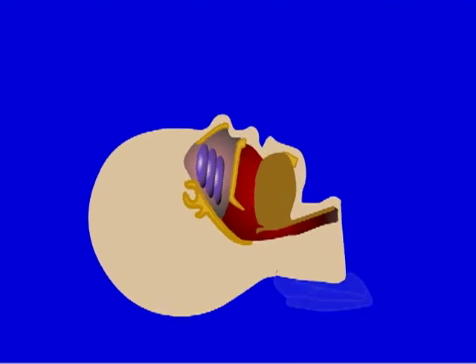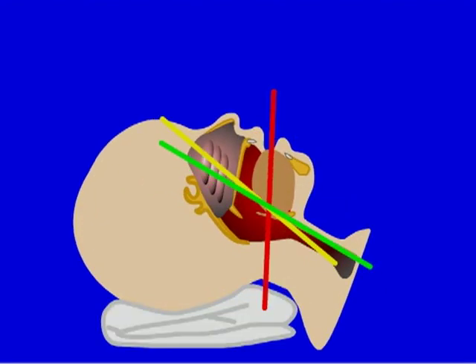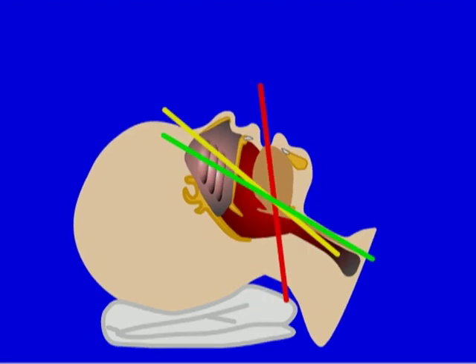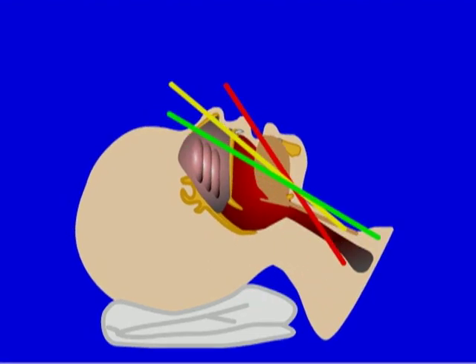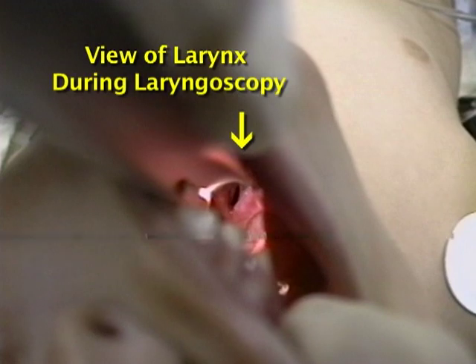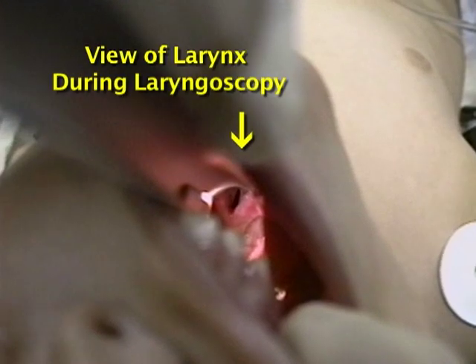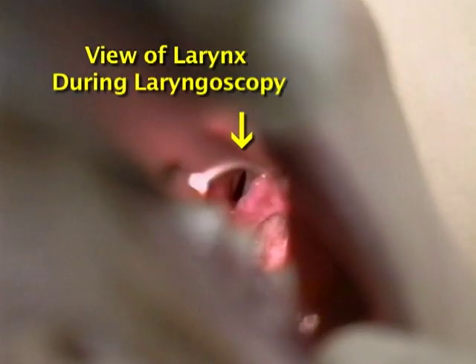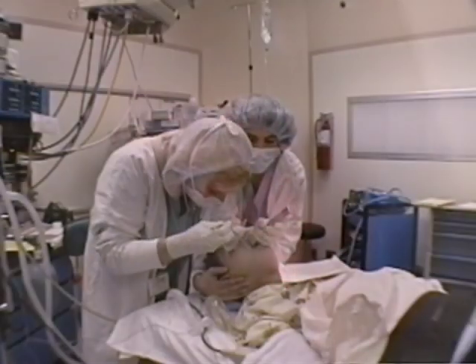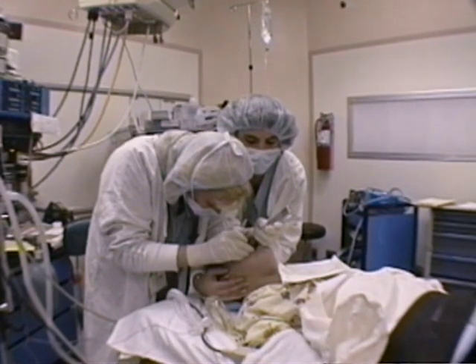Infants may need a small towel under their shoulders to compensate for their prominent occiput in order to bring their airways into alignment. Older children may need a small towel under the head. The laryngoscope blade then lifts the mandible to bring the oral axis in line with the other 2. The larynx usually comes into view. Other techniques can be used in situations when the patient's head and neck should not be moved, such as cervical trauma.